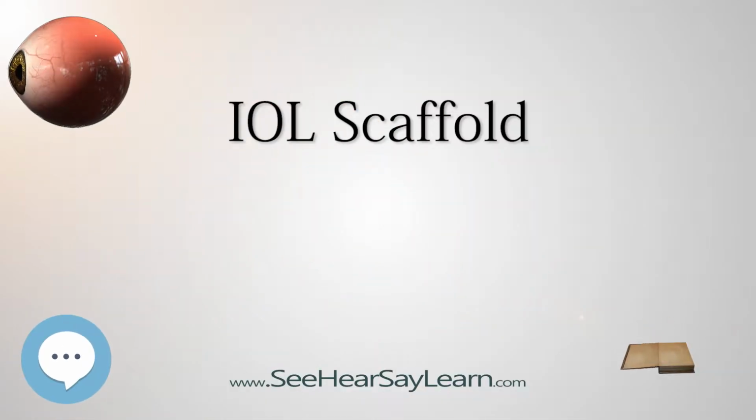IOL scaffold or intraocular lens scaffold technique is a surgical procedure in ophthalmology. In cases where the lens bag is ruptured and the cataract of the eye is not yet removed, one can inject an artificial lens or intraocular lens, IOL, inside the eye under the cataract. This way the IOL acts as a scaffold and prevents the cataract pieces from falling inside the eye. One can then remove the cataract pieces safely by emulsifying it with ultrasound.